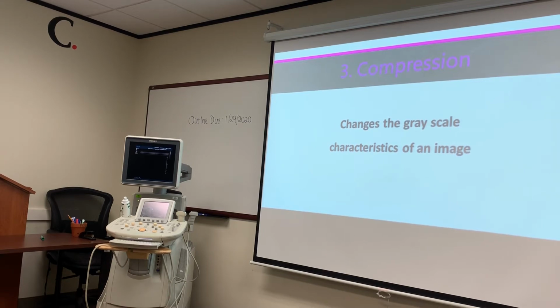Looking at that image, I'm going to give you guys a second to think about it. Please don't look at the answer explanation first. But just eyeballing that purple dotted line to the left of the red line, is that new transducer of higher frequency or lower frequency? Lower frequency. It goes deeper. Lower, because the near gain is to the right. Lower? I would say it's deeper.